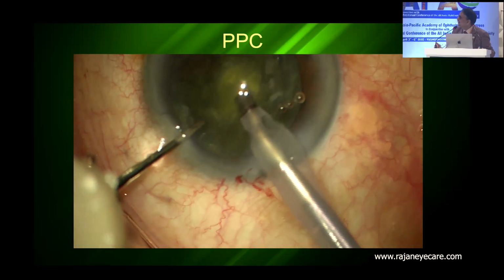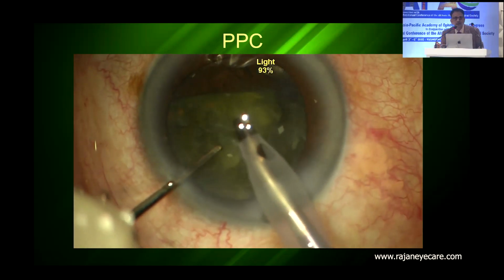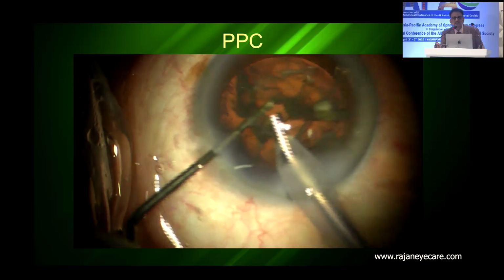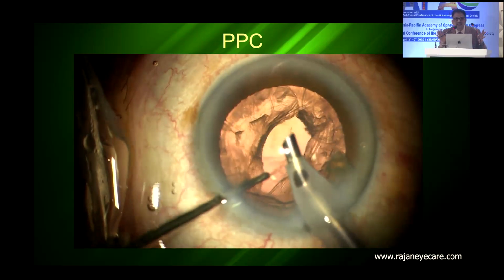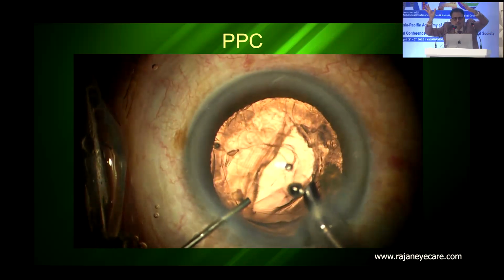You can see what's happening now. So I'm taking the epinucleus. So far so good, I was telling him everything is going on well. See suddenly what's happening. This is the problem with the posterior polar cataract. It is not a PCR, it's a PC dehiscence. There is a congenital dehiscence. You can see the two pillars on the posterior capsule.